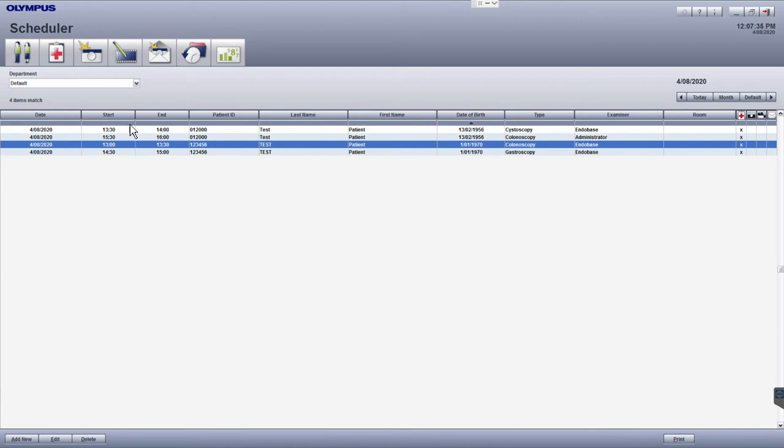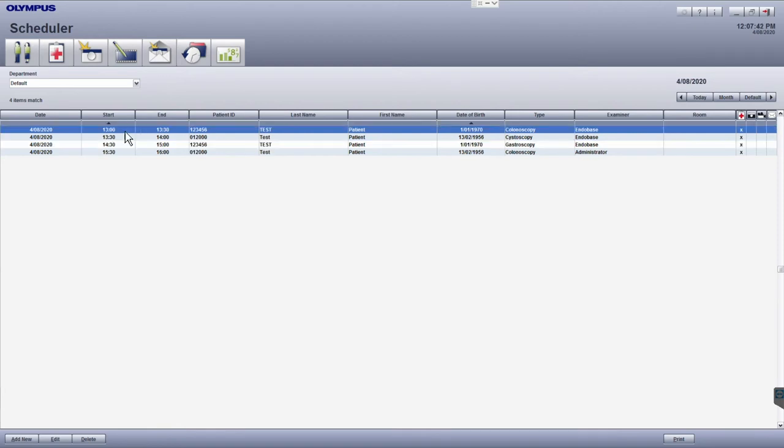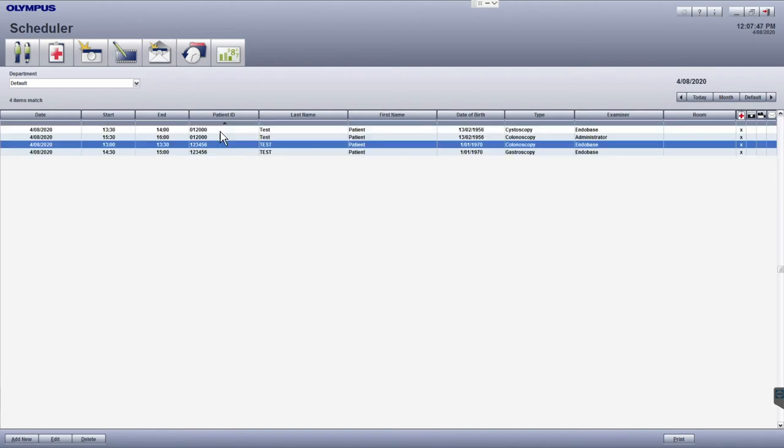Just under the column headers is a grey strip which allows you to sort the data. A typical sort will be in the order of the time an examination is scheduled to start, but you can also sort for other columns as well. A black arrow will appear to indicate where and how the information is being sorted.